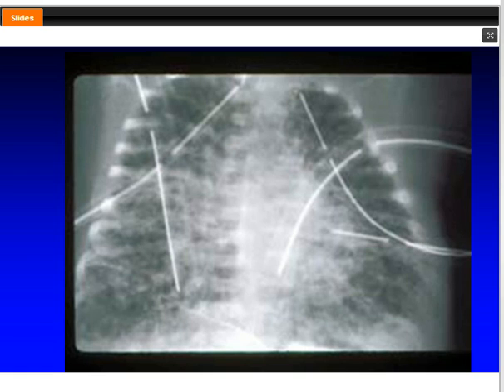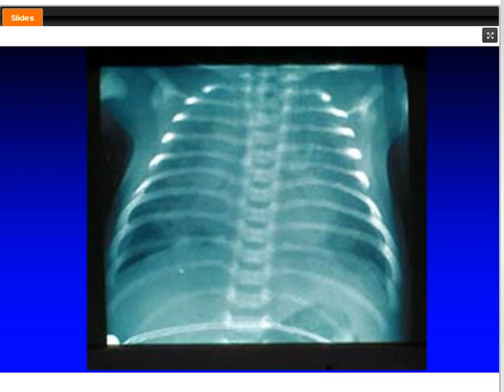And again, these patients are going to need more mean airway pressure to get the lung open, but they still need the lower frequency, because if they have meconium in the airway, that will predispose them to air trapping and create problems for the baby. And this is a baby who, again, doesn't really look like meconium aspiration, but had some meconium suctioned from the airway. So this baby gets treated more like a baby who has an RDS, hyaline membrane type picture, because it's more of a surfactant inactivation issue.